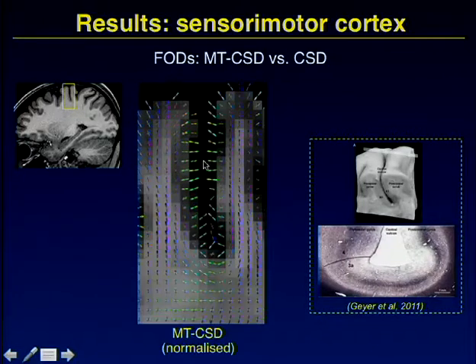There is actually very coherent information, but what it's telling us is that the amount compared to whatever there from the diffusion, from the gray matter, it was only a tiny proportion of that one is really a coherent structure. The rest is all pointing in all funny directions. But the remaining one that is there, it is coherent.